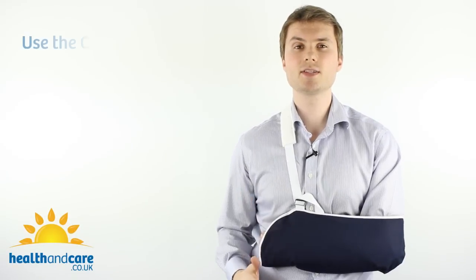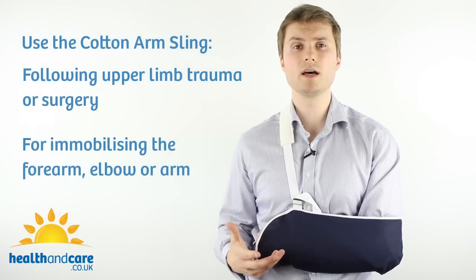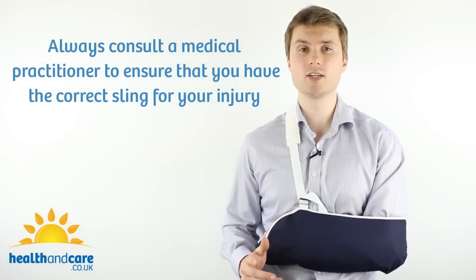The Cotton Arm Sling can be used after upper limb trauma or upper limb surgery and it can be used to immobilise the forearm, the elbow and the arm, but always consult a medical practitioner to ensure you've got the right sling for your particular injury.